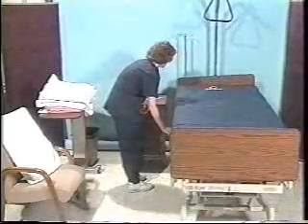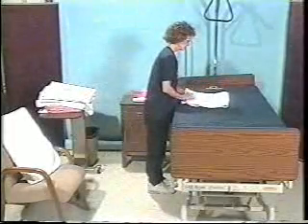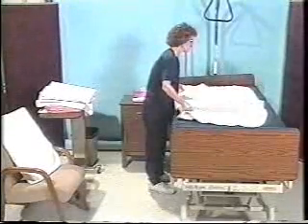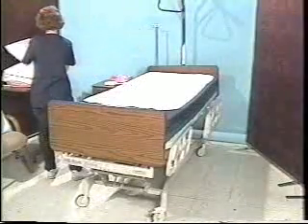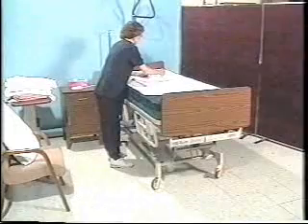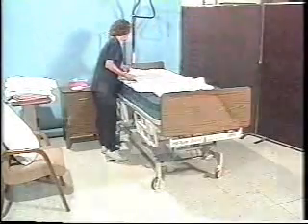Next, she pushes the mattress to the top of the bed, then places a mattress pad on the bed and unfolds it so it is even with the top of the mattress. To save time, the bed should be made one side at a time. The caregiver unfolds the bottom sheet so the center crease is in the middle of the bed and the bottom edge is even with the bottom of the mattress.